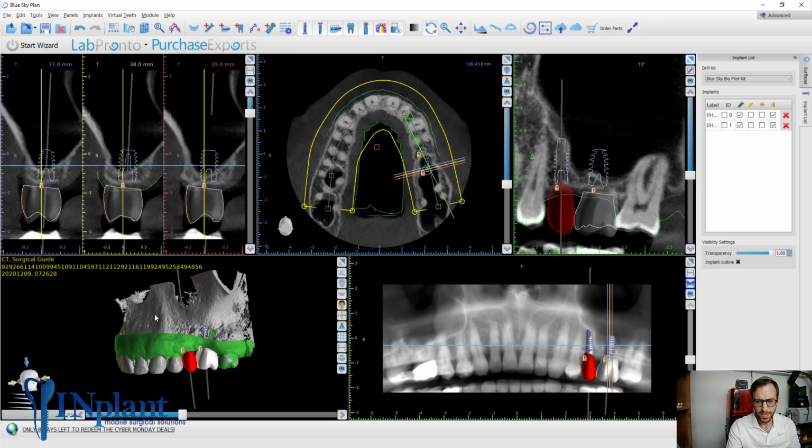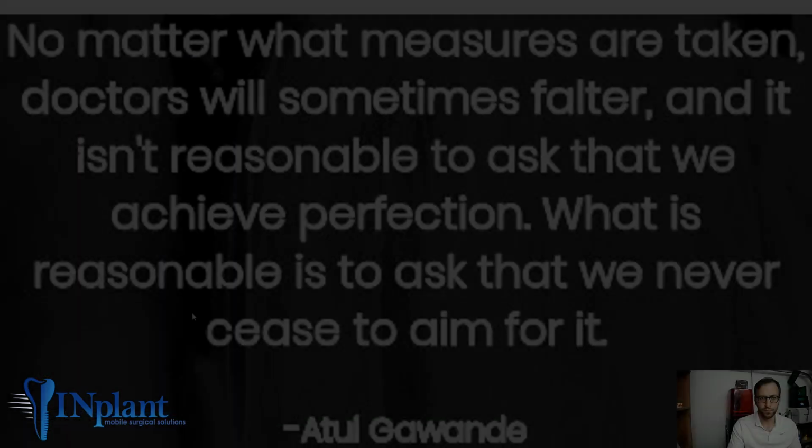So as we discussed, we set up a surgical guide. We planned for a sinus lift for 14 and 13. We were going to kind of avoid the sinus, and we picked up a lot of information as we did it. And let's get into some of the x-rays of how we got this done.